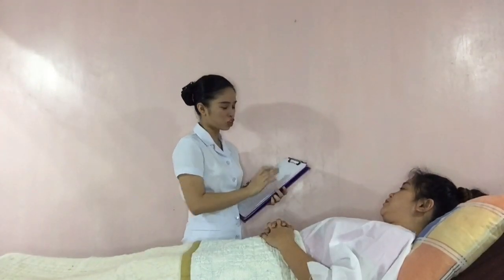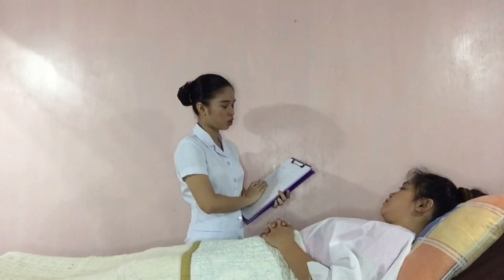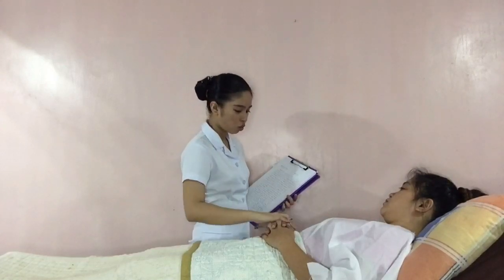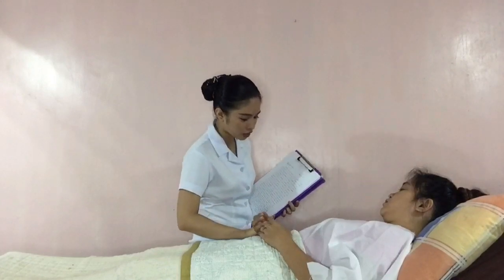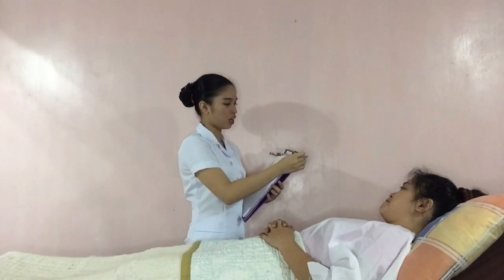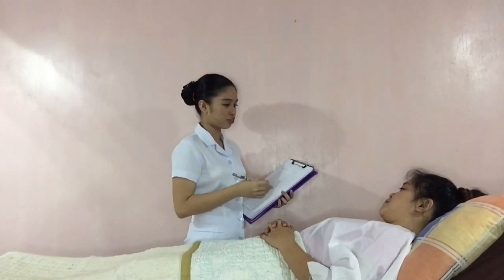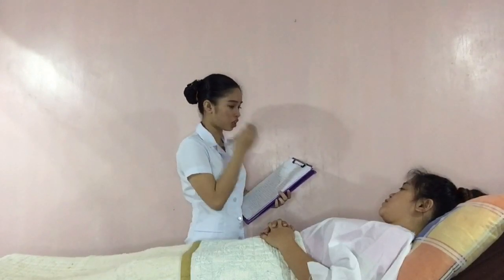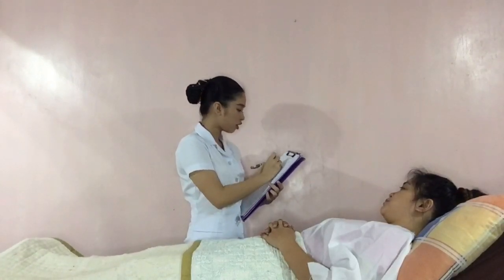By the way, the procedure that I will be doing is that I am going to administer the medication through intradermal injection. I will be injecting into the skin of your arm. This is for us to know if you have any allergies or to test for your sensitivity. This may hurt a little, but I want you not to move when I am injecting. Is that okay with you? Okay.